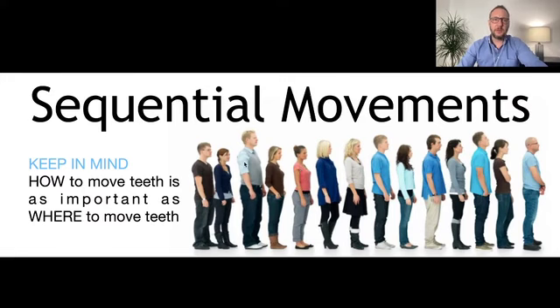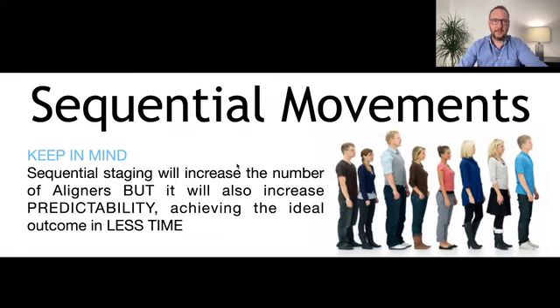I need to figure out how I want to get there, okay? And also, it's important because a lot of times when I'm treating cases with the treatment planning service of DST, we are implementing strategies, okay? And then we understand for this kind of malocclusion, we need to create sequential movements. First move this one, use the other anchors. Then when this one achieves the position, we need to start the other.